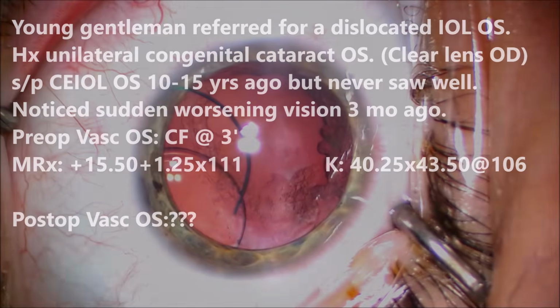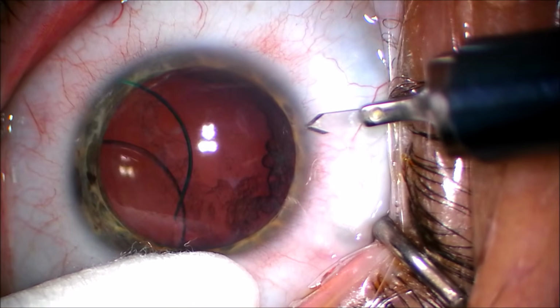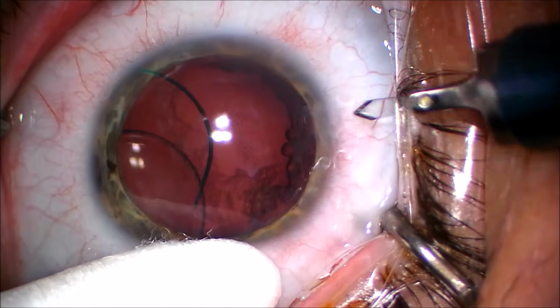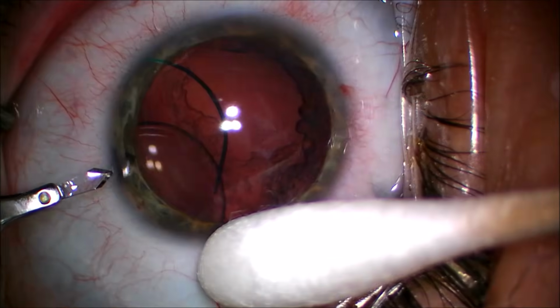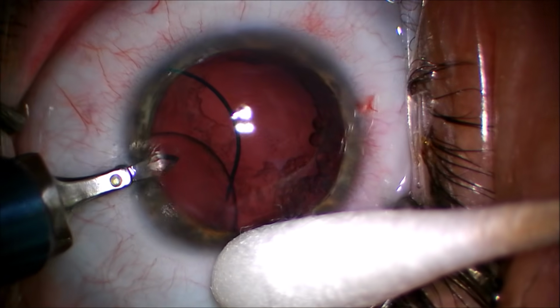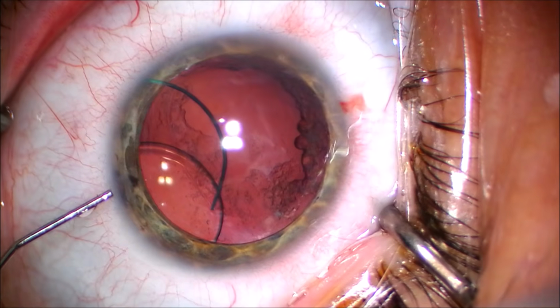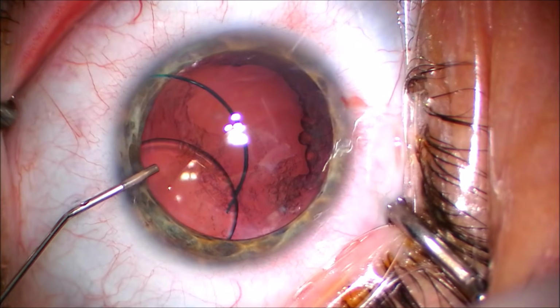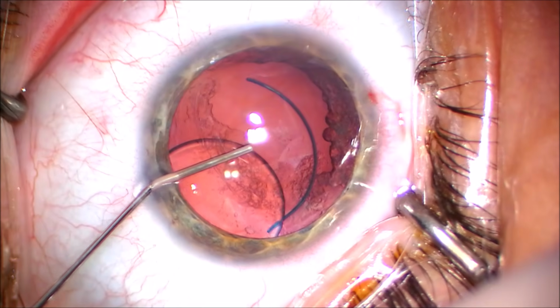So you can see this is the eye. You can see the fishhook haptic hooked on the pupillary edge. I'm going to make my incision first on the right side and then the left side. These are my paracentesis incisions, making sure I'm flat to iris plane. This is some intracameral epinephrine. You can see how loose this lens is, and the patient has a pretty big eye.